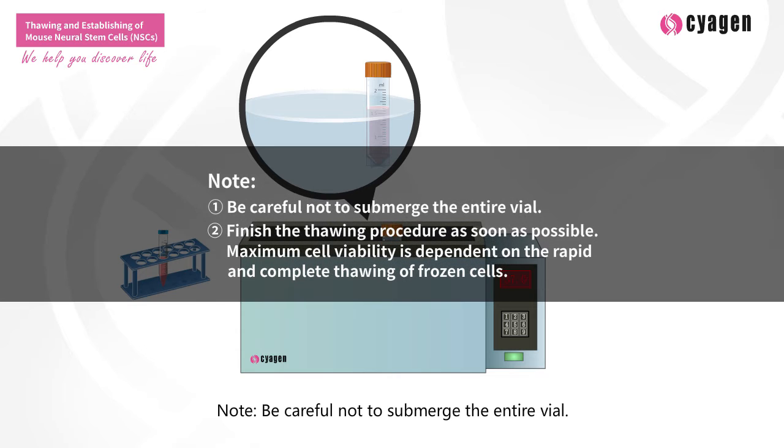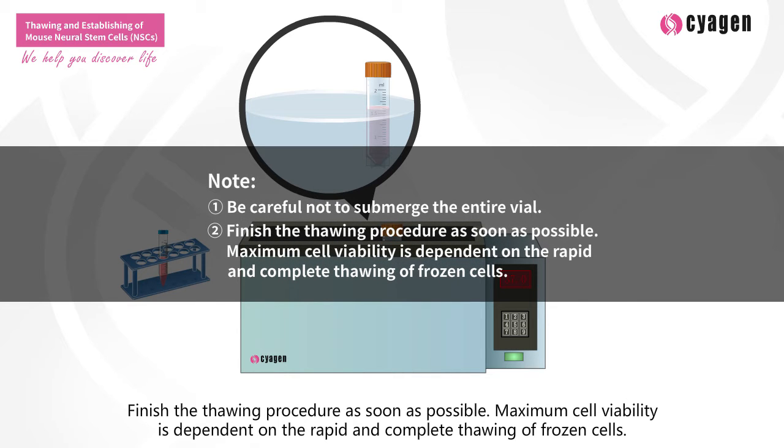Note: be careful not to submerge the entire vial. Finish the thawing procedure as soon as possible. Maximum cell viability is dependent on the rapid and complete thawing of frozen cells.